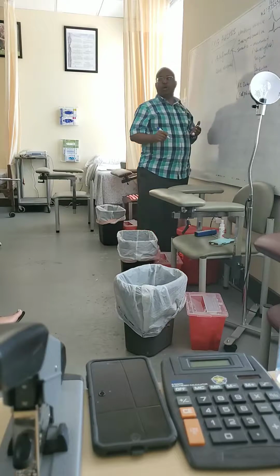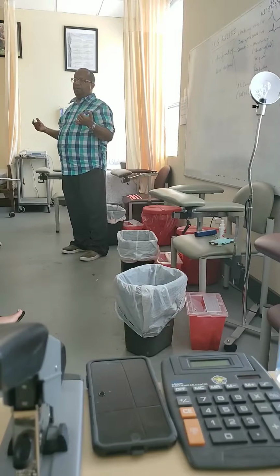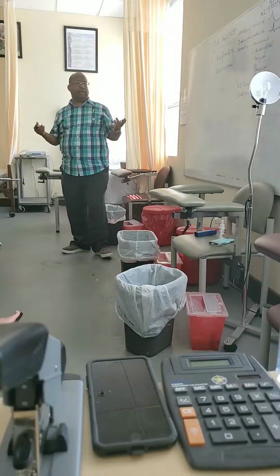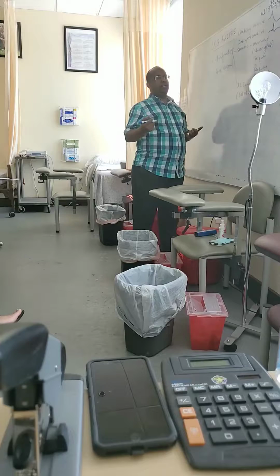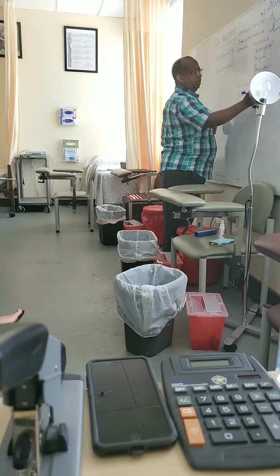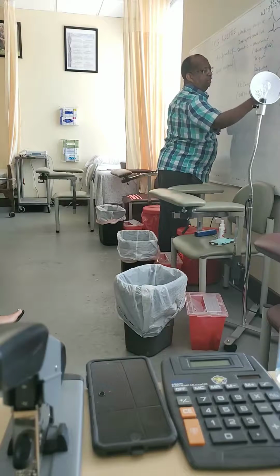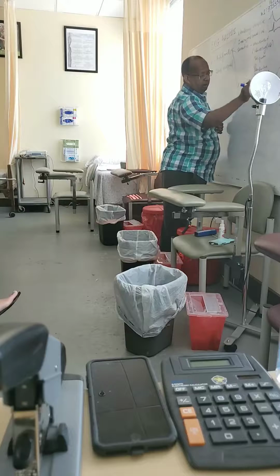So we always need to ask the patient if they have a cell phone or not. Belts, yes, metal belts. And another one is an IV pump, which is a machine where an IV is being pumped.